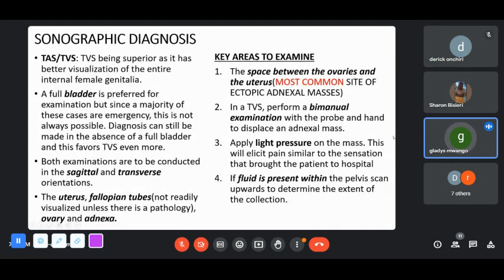What about in a transabdominal? What are some of the challenges that you've had when doing a transabdominal scan? Now you can have somebody else answer that. This is supposed to be interactive, so we can discuss the challenges and see how we can navigate that, and going forward.